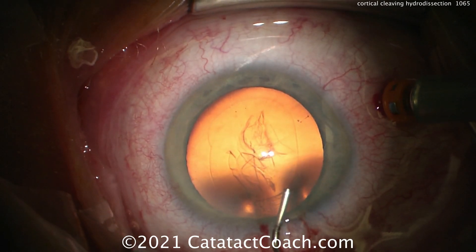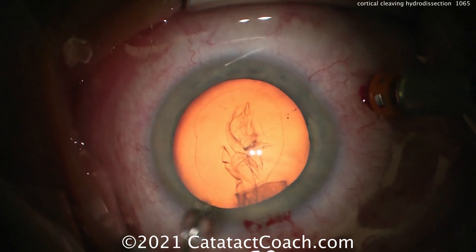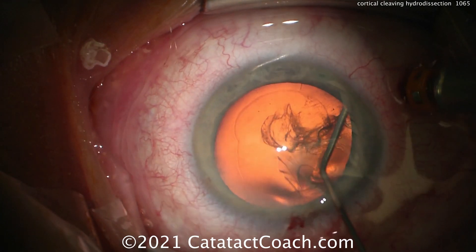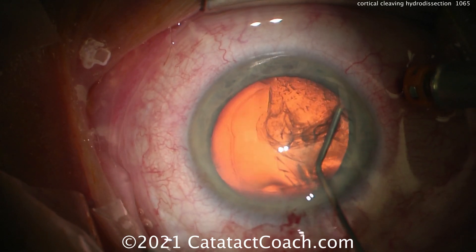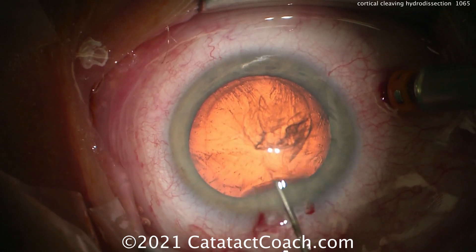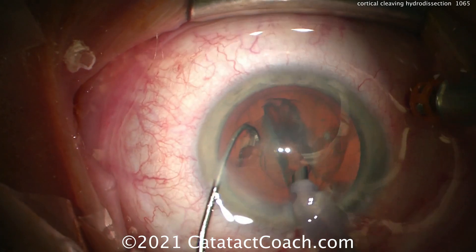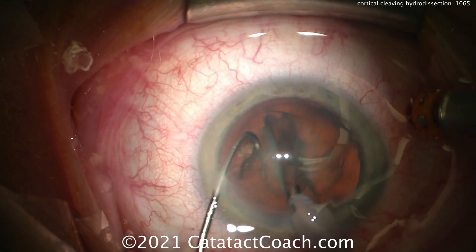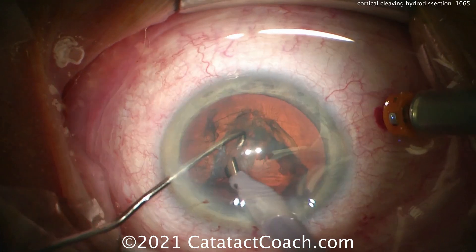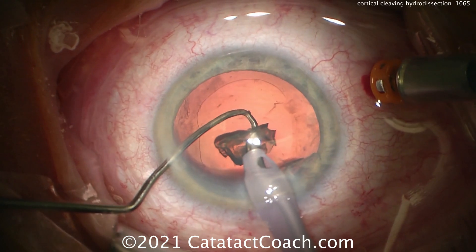Let's watch Rishi's video one more time in slow motion to see how this hydrodissection is done. This cortical cleaving hydrodissection requires tenting up that capsule — there it is. We want to get a fluid wave across — there's the fluid wave, it finally gets across — and as it goes across, it really separates the cortex from the capsule. At the very end, as that last nuclear piece comes out, there's really nothing left in the capsular bag.